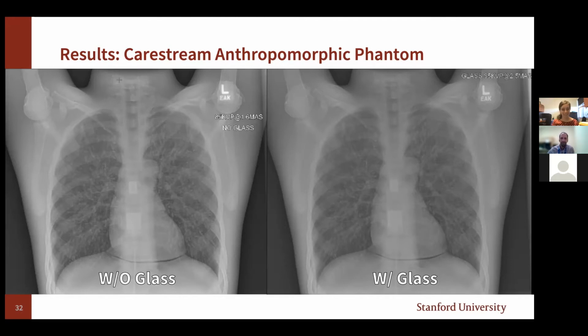So we actually have two questions here. Thank you for the very interesting talk. I'm wondering if the refraction of the X-rays by the glass is a considerable factor at all for image quality. Oh, that's a good question. We didn't see any sort of X-ray refraction, but that would be something observed through high resolution MTF analysis rather than contrast to noise.